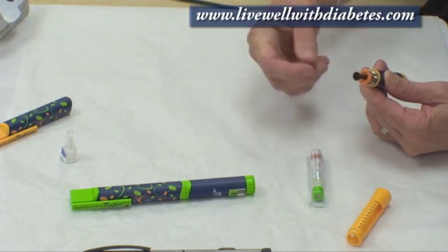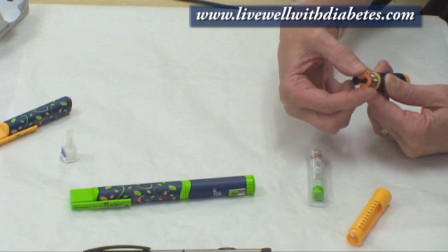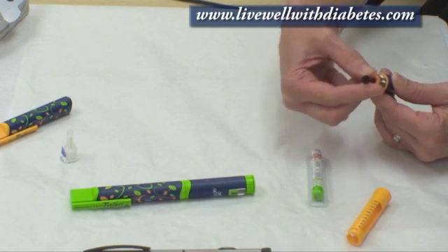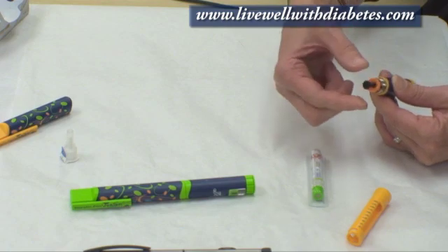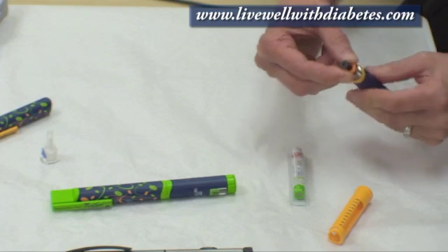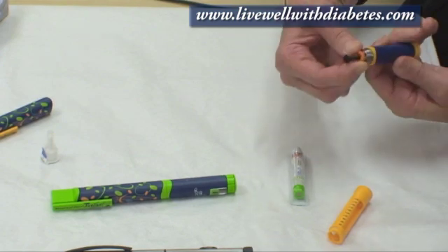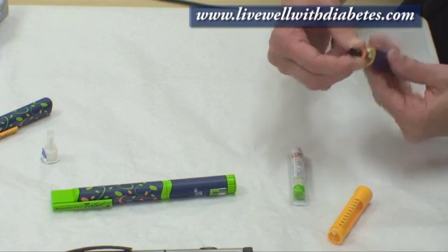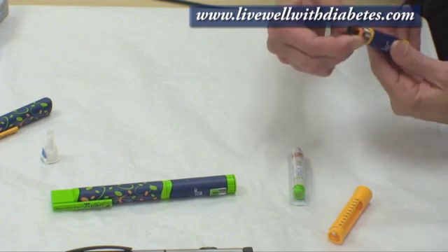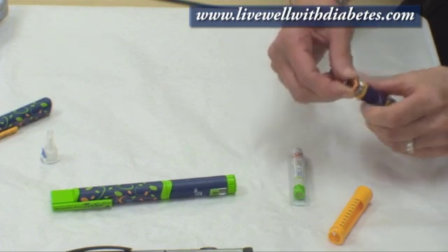To retract the piston, you hold on to the orange ring and you can either turn that orange ring, or hold the orange ring and turn the blue part. If you go the wrong way it'll get longer, so to retract it you just go the opposite direction and turn it all the way until it's flat.